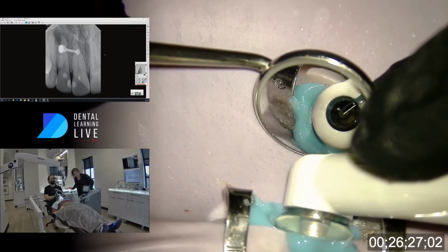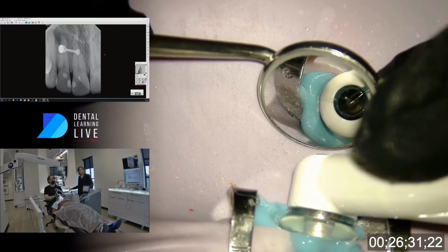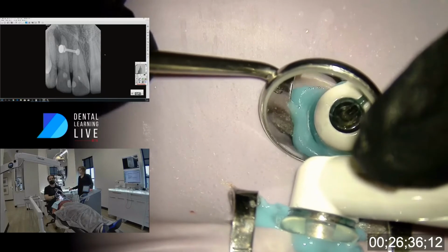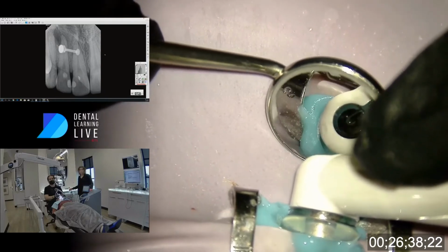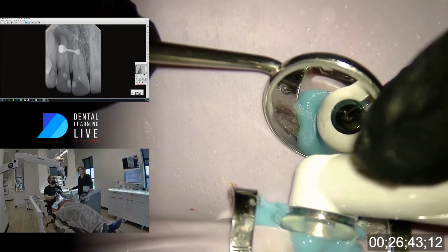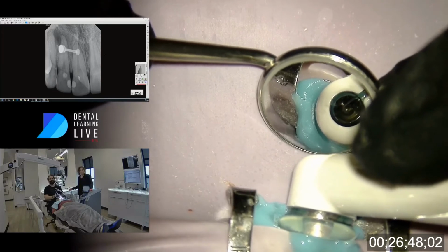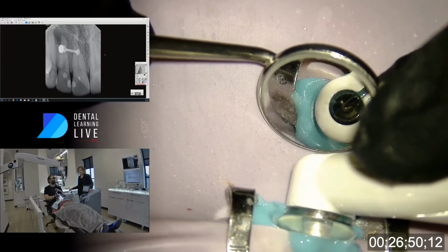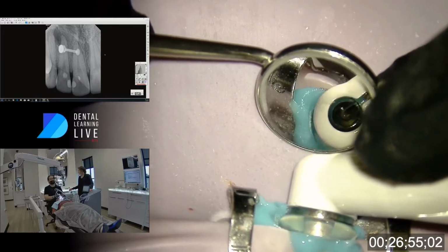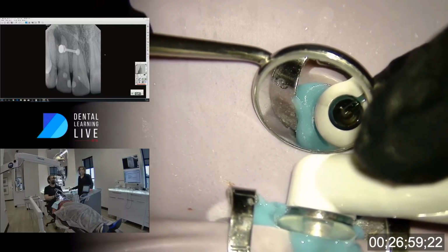We have, looks like we've gone through the rinse cycle here. Now this console does it all by itself. I'm just holding this, and if there's any spurts or leaks, Lindsay can suction that up, but we're really pretty darn dry right now. Okay, so we've gone through a rinse cycle, and it's cleaning the bleach out of the lines, the tubing, and the tooth. It takes about 30 seconds. And then EDTA begins, and it's just passing through the same tubing. And this will run at a concentration that hovers around 8%.